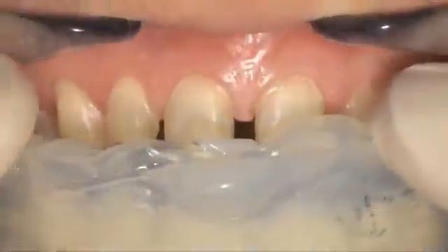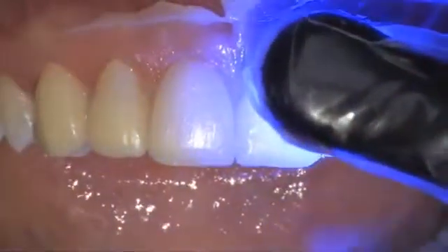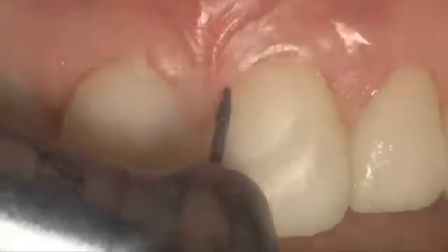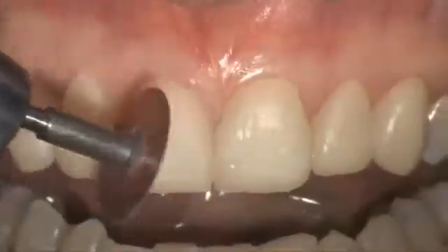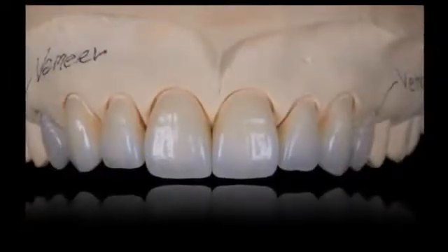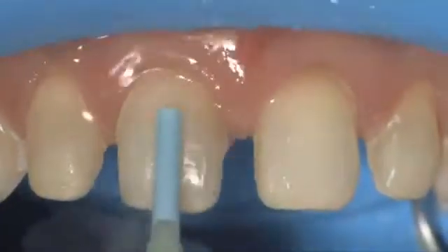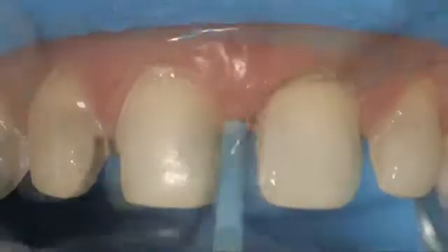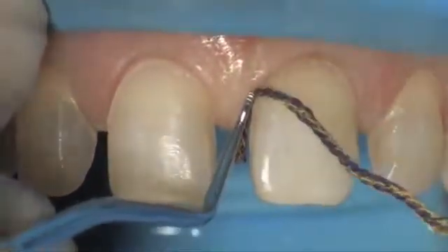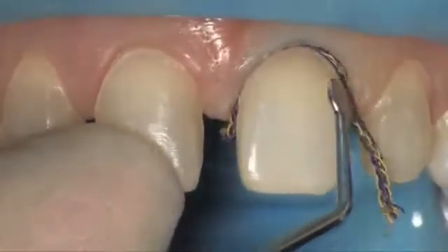The same transparent silicone index used for the previsualization was also used to create a direct temporary. After the light curing, the temporary can be refined with fine diamond burs and Soflex discs. Upon the receipt of the final restoration, the temporaries were removed and the teeth were cleaned. A dry double zero cord was also used to protect the sulcus from the resin cement infiltration.